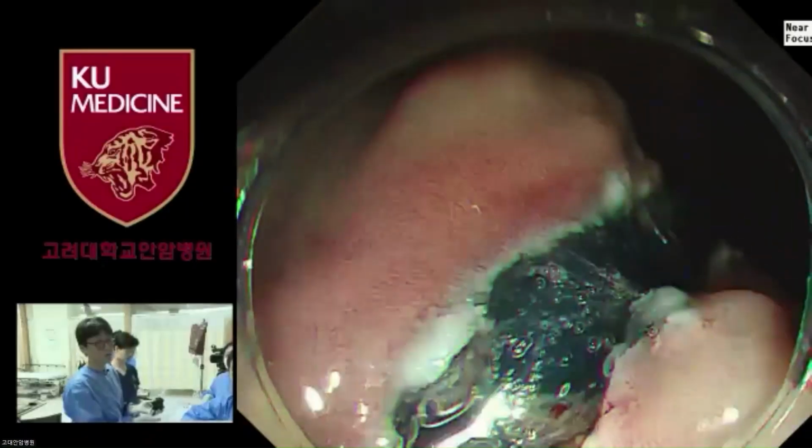Yes, sometimes we have various kinds of different knives. Some are only a dual knife, or sometimes a dual-function knife, including the knife and the injection solution simultaneously. We only use a knife where you can inject. For us, this is our standard, so we inject throughout the whole procedure, simultaneously. Yeah, that's better.